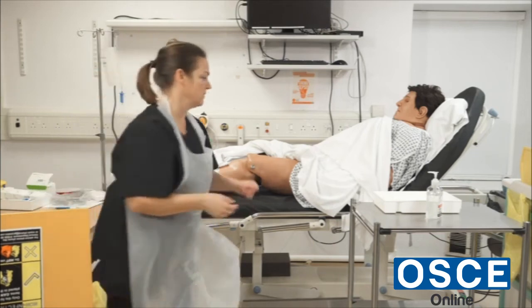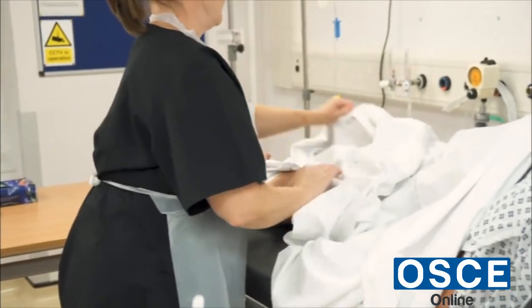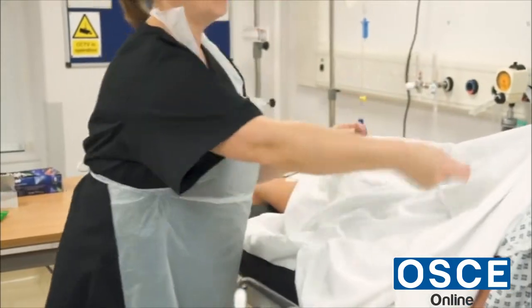I remove my gloves, gel my hands, and cover the patient back up. The catheter is out now and I'll give you the buzzer.